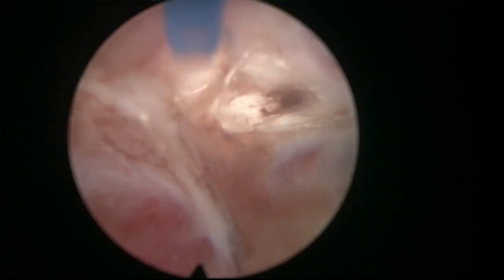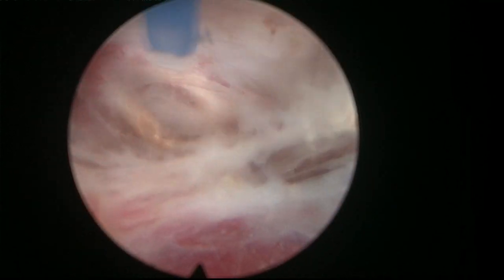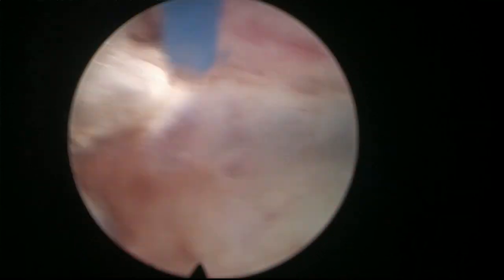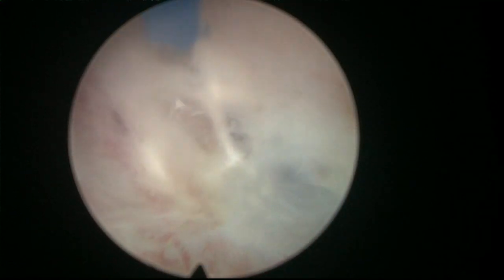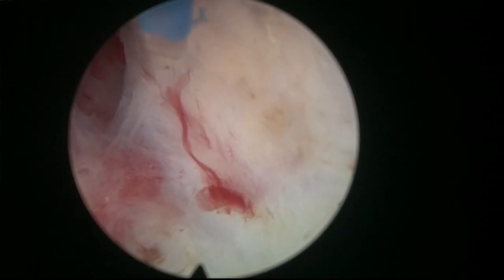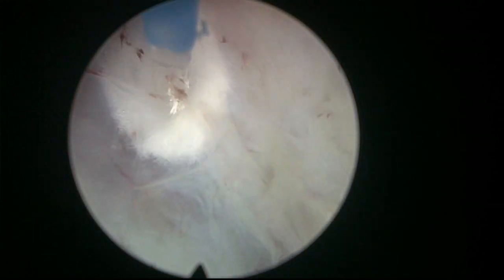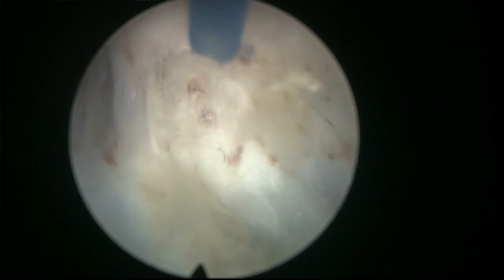And here, you see, the fact that we are dissecting a circumferential plane makes it very easy to recognize. And in some areas you're not totally sure of, maybe you see this and you think, this is a good plane. Okay, let's go up a little bit. Let's go down a little bit, you see? This is going to give you some orientation.